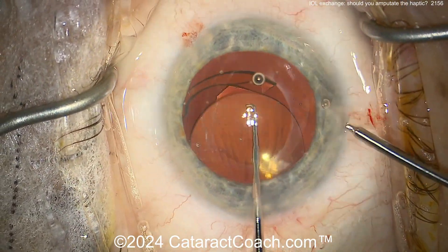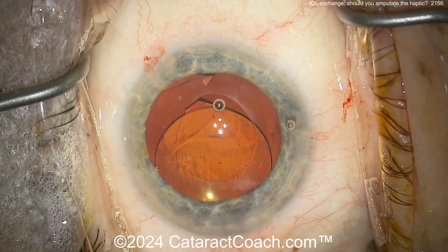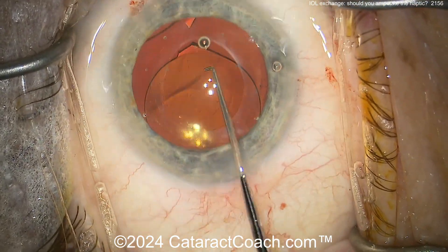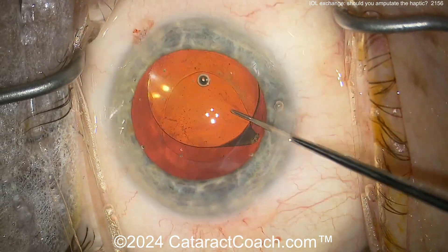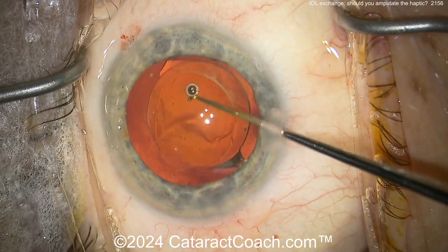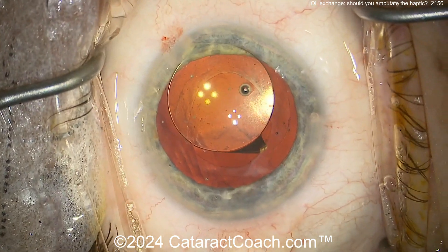You can see the capsule bag equator there — breaking zonular support. I would not do any more now. You could see that part of the capsule bag equator as that haptic was pulled, and that's telling me you're going to have a risk of breaking the bag and/or causing zonulopathy.